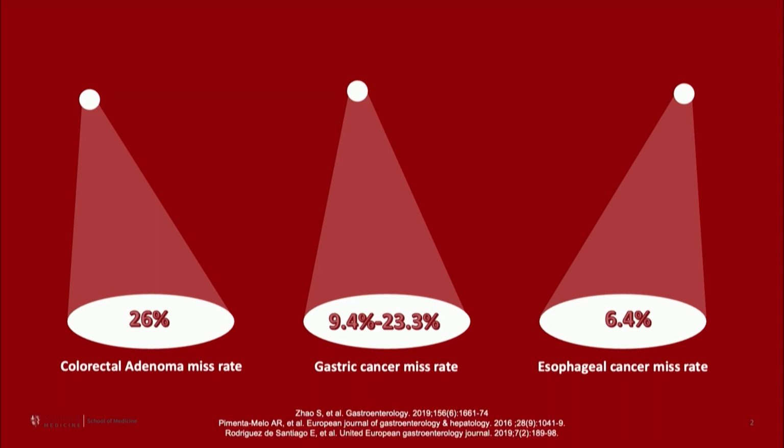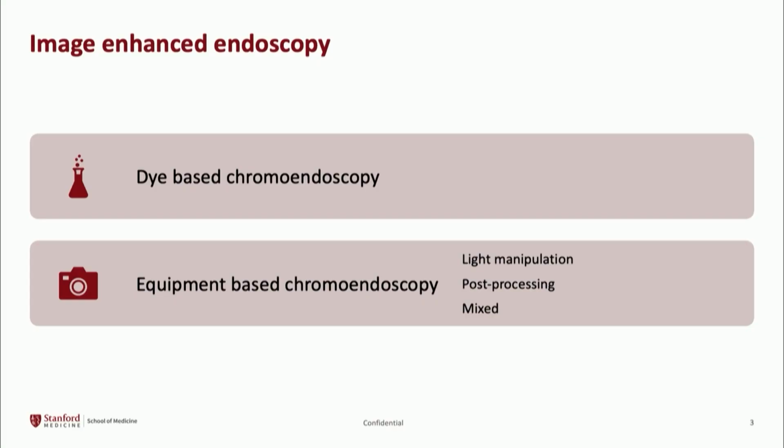And one of the improvements in technology is image enhancement. As the name itself suggests, it's basically enhancing the surface features or enhancement within the equipment to improve the diagnosis of these lesions.